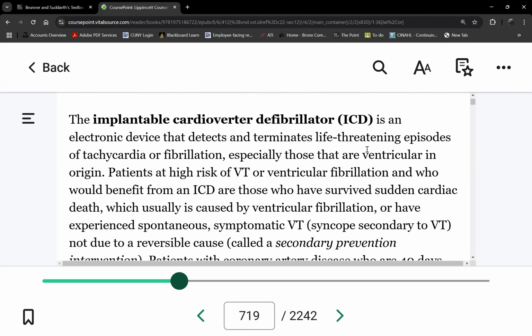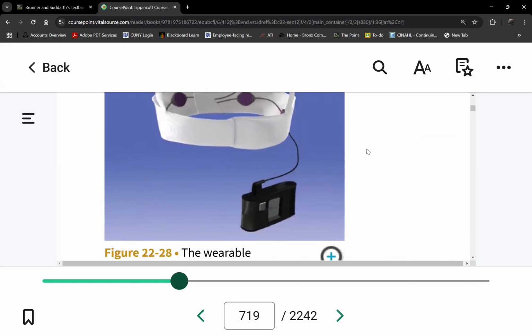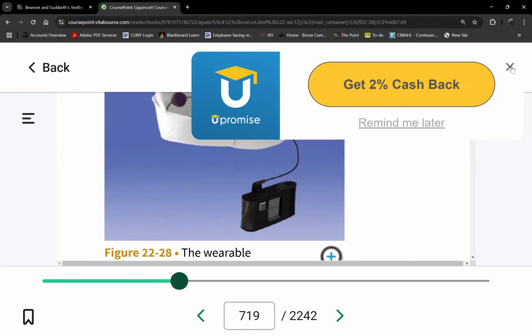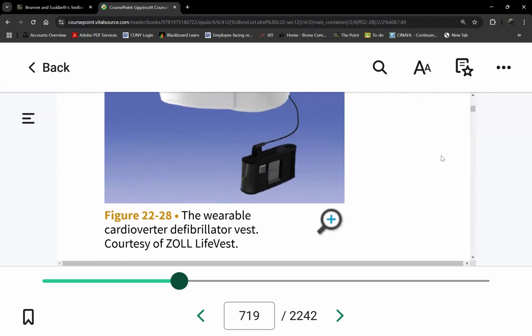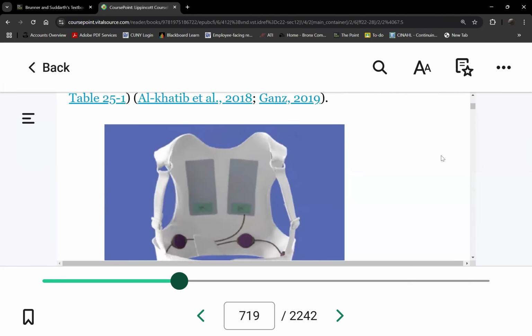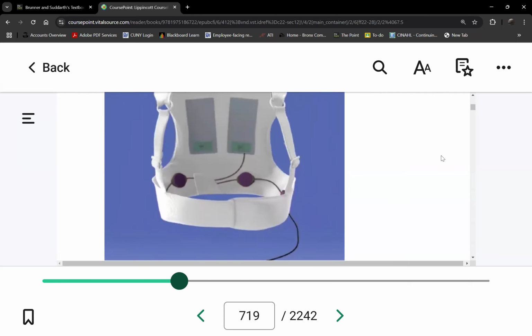Yeah, so this might be a stupid question, but are they plugging it in every night? Which one? The vest, the ICD? Of course, yeah, the vest would, if it's the Zoll, because it's an external battery, yeah, you need to charge it. That's wild. Is it heavy? Very, yeah, it is a large battery. The vest itself, I mean, it's Velcro, it's a canvas, so it's light, but the battery is heavy, because you need a lot of power to defibrillate somebody.